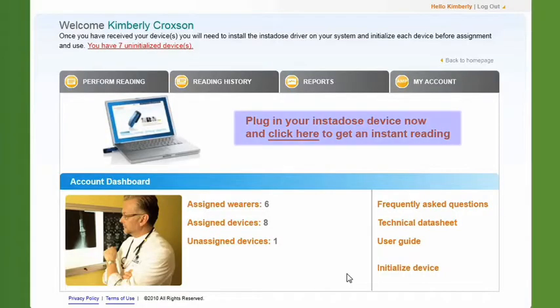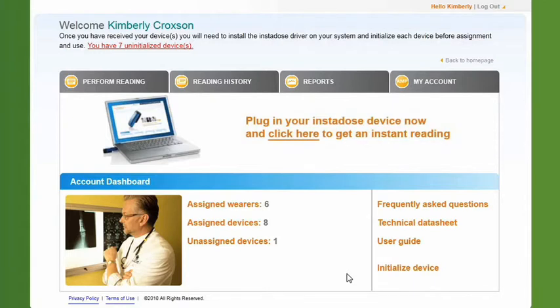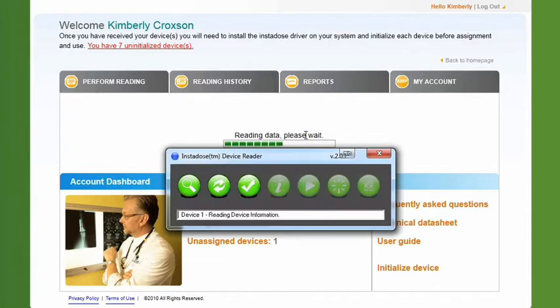To perform a reading of your badge, from your home page, click the message: 'Plug in your InstaDose device now and click here to get an instant reading.' You can also click on the Perform Reading tab. After clicking, the driver will launch and the accumulated exposure stored on the device is processed through a proprietary algorithm. This fully automated transfer of data minimizes the chance of human error and misidentification.